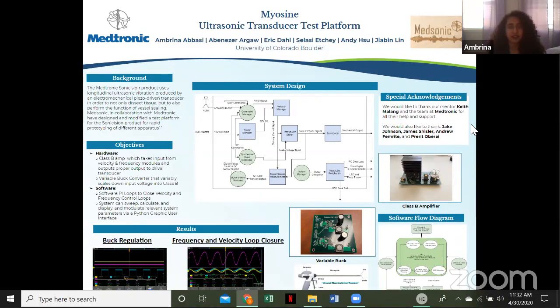In the body, we have different types of tissues with different impedances, and the previous team was only able to implement an open loop feedback algorithm in which the user had to manually program for that specific impedance. We were tasked with making changes that would allow for easy, user-friendly, and autonomous operation.